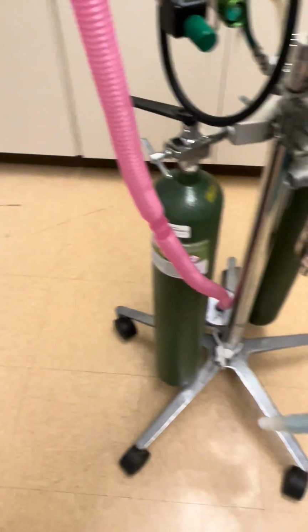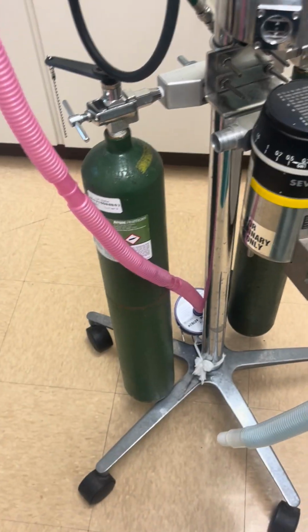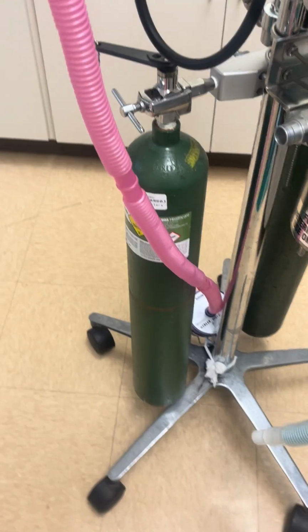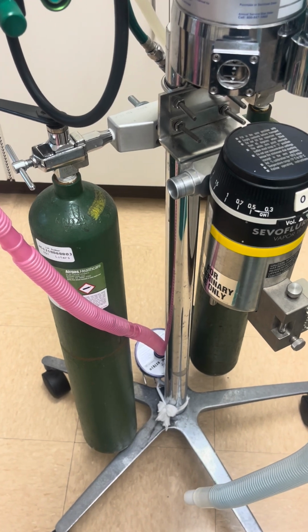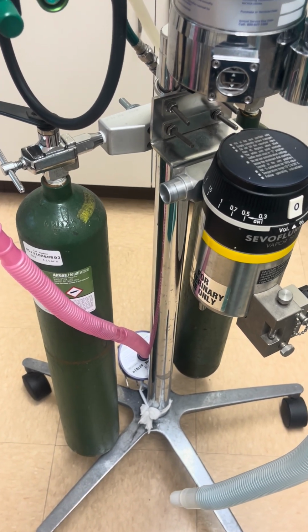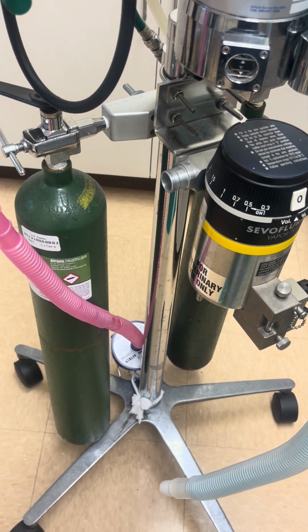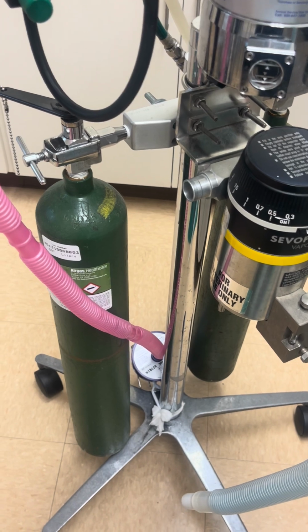And those usually stay attached to the wall because since they're oxygen, they are combustible, so they have to be chained to the wall. Because if they fall, they become a huge missile. And then the H cylinders contain about 7,000 liters. And like I said, both are combustible. You always want to make sure your O2 is on to do your pressure check and check for your PSI.